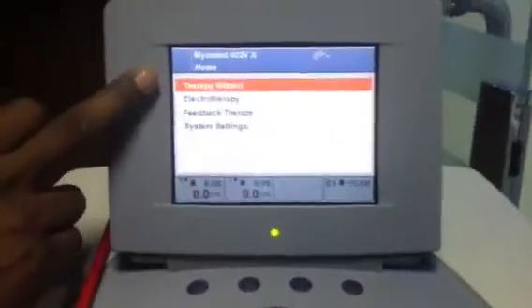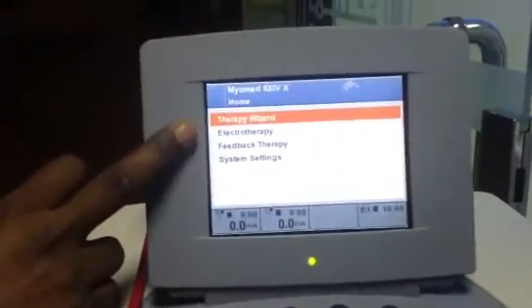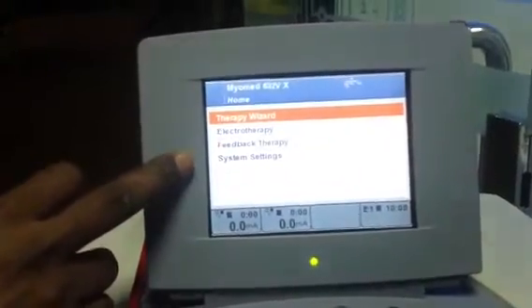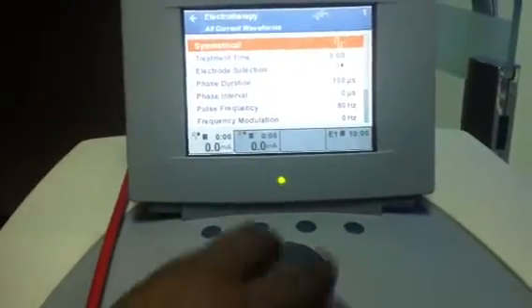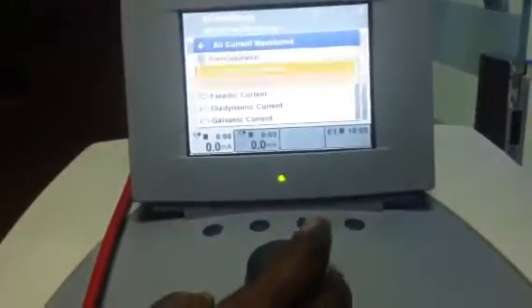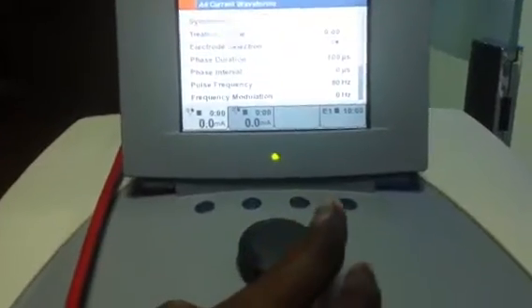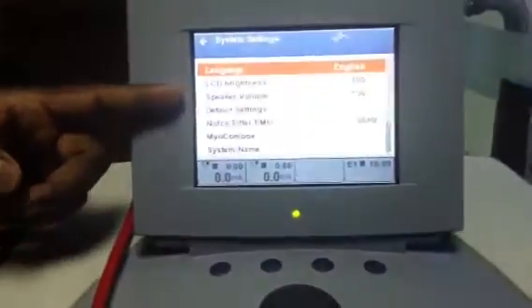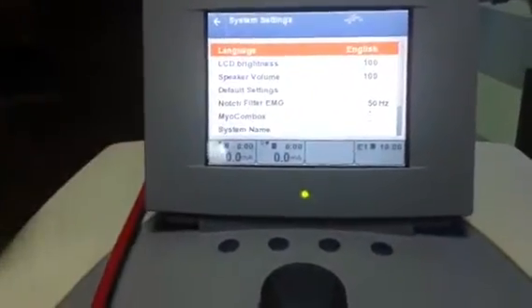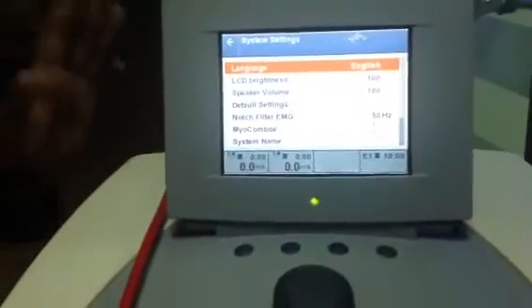Now the display shows: Therapy Wizard, Electrotherapy, Feedback Therapy, and System Setting. The System Setting means language, the brightness of the screen, the volume of the speaker, any default settings, and how much EMG threshold you want — all system-related information.